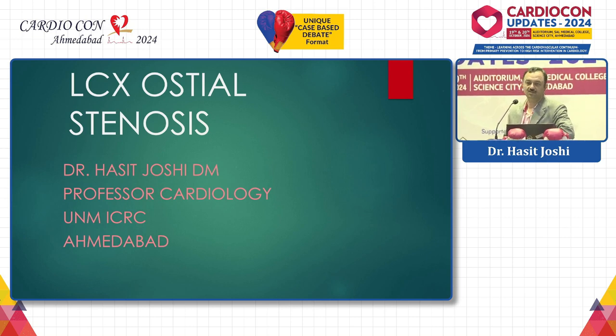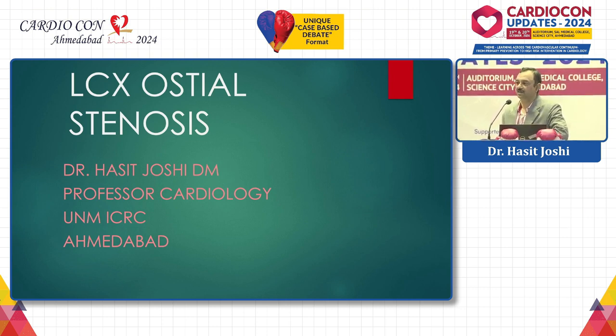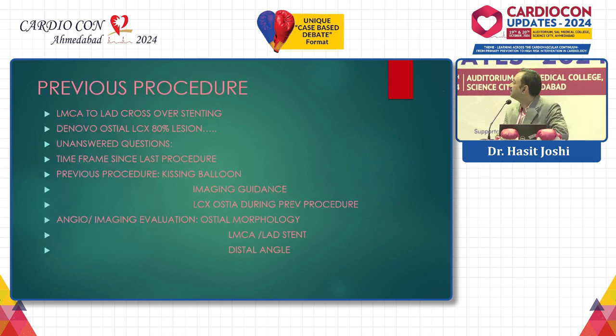LCX ostial stenosis itself is a controversial thing, and probably there are some trials of directional atherectomy with DCB in isolated LCX stenosis. However, our case, which is a provisional stenting, crossover stenting, LMCA to LAD, has now presented with a new lesion. De novo ostial LCX lesion, 80% lesion.